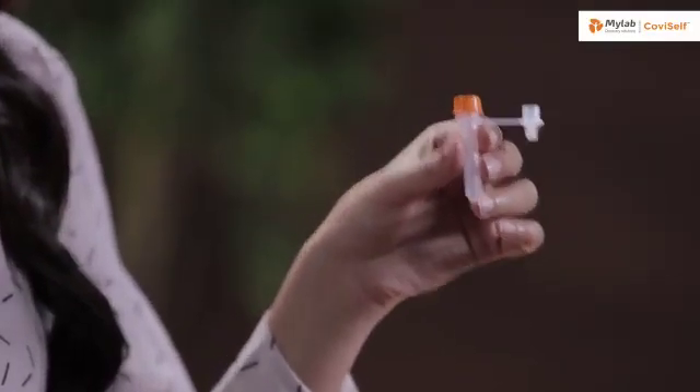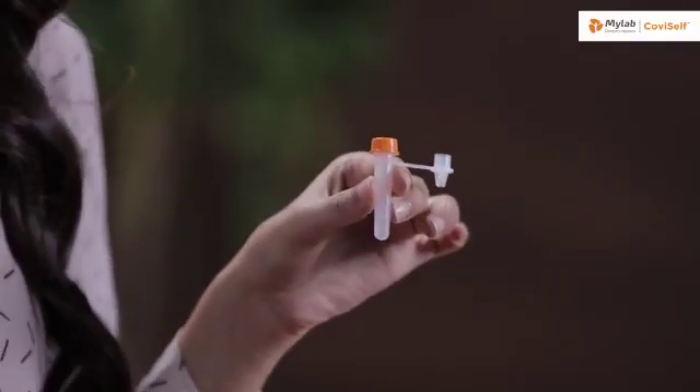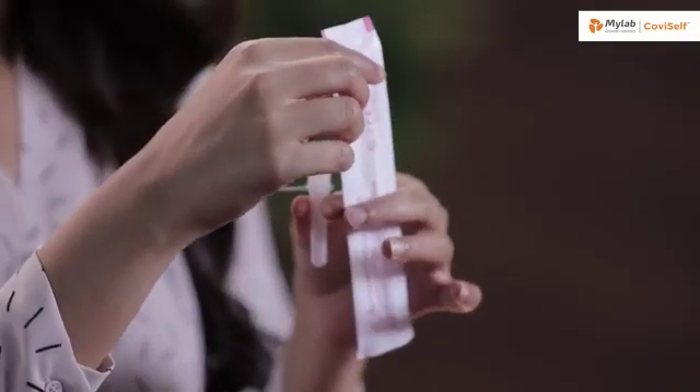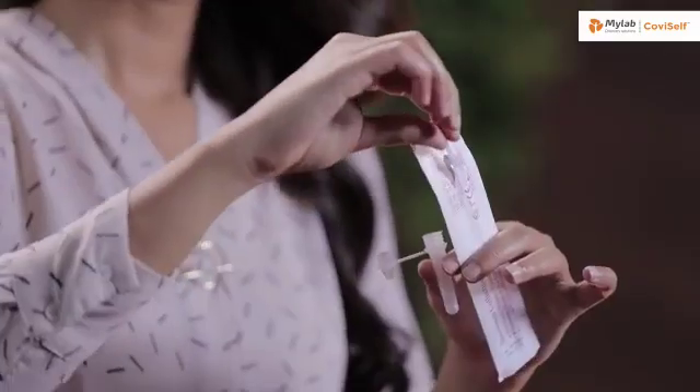Take the pre-filled extraction tube and tap it gently three or four times to ensure that the liquid settles at the bottom. Unscrew the cap and hold the tube in your hand. Open the sterile nasal swab while holding the tube in your hand. Tear it from the tail end.